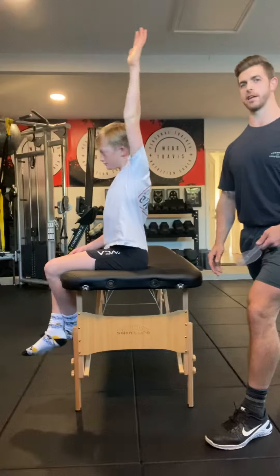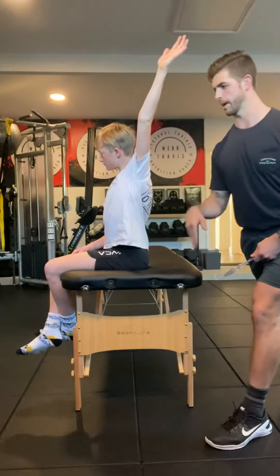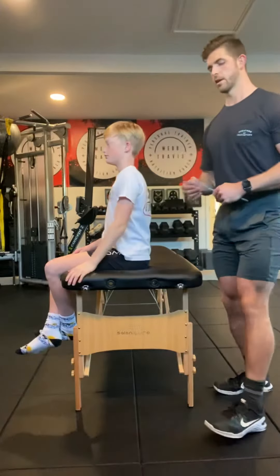Go ahead and raise your arm as high as you can get it. Good — let's not go too far, we want to make sure it shows parallel. Good. Now bring it back down and relax.